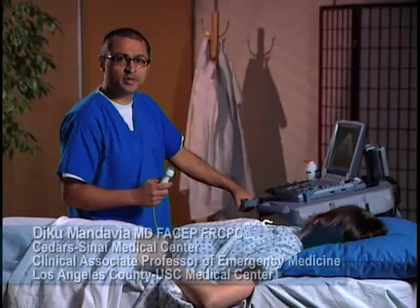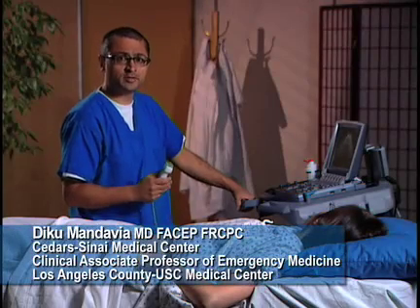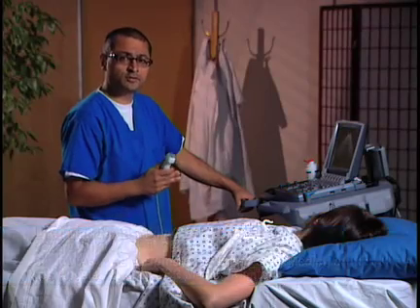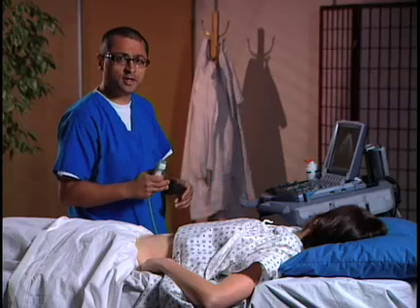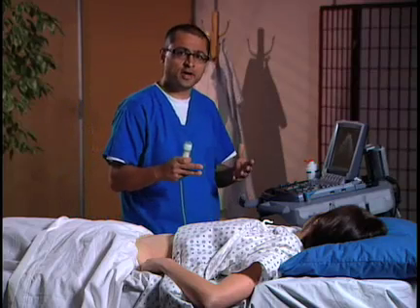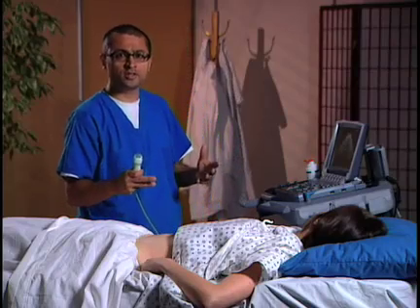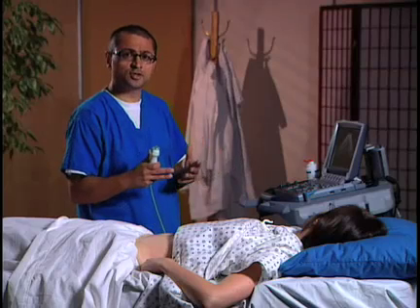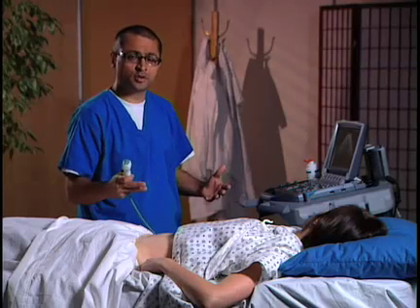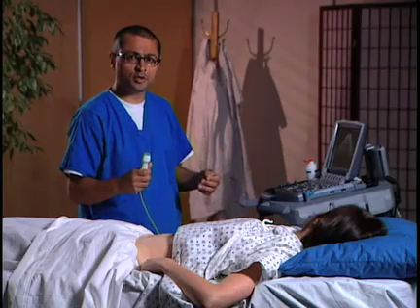In evaluating first trimester pain and bleeding, a pelvic ultrasound is a critical part of the evaluation. Our goal in the emergency department is to identify an intrauterine pregnancy. We can evaluate the uterus in two basic ways: one is a transabdominal approach and the other is a transvaginal approach. Right now I'm going to show you the transabdominal approach.